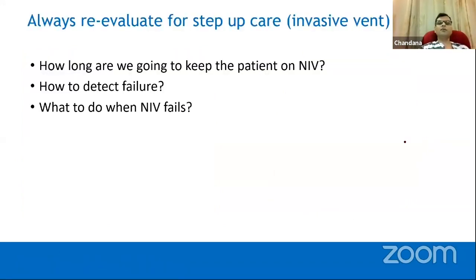Okay, so you start certain settings, and generally you start with a lower setting and then gradually go up. You can look at the guidelines, but I'm not going to discuss them because they keep changing. Generally, you can start with lower pressures, lower PEEP or lower EPAP, and lower pressure support, and gradually work on the pressures until the patient settles. Otherwise, if you start with a high flow rate and high pressure limit, it is invariably associated with rapid pressure development, and the patient finds it uncomfortable.